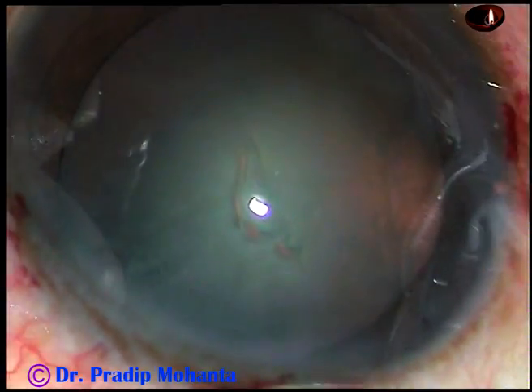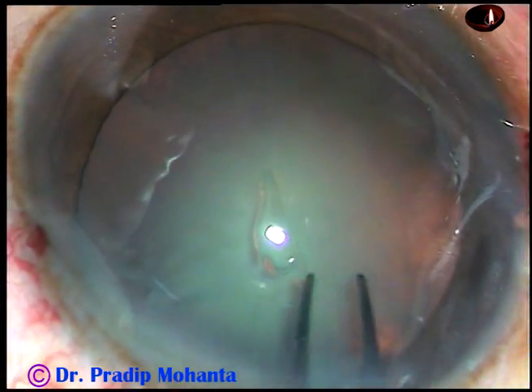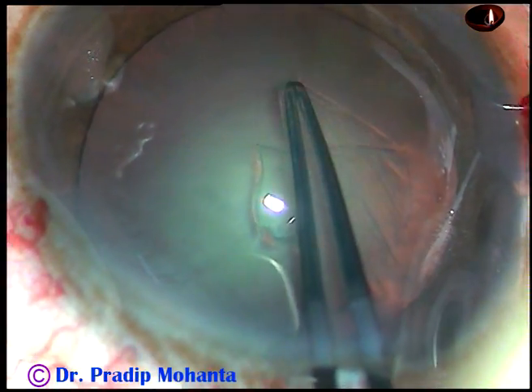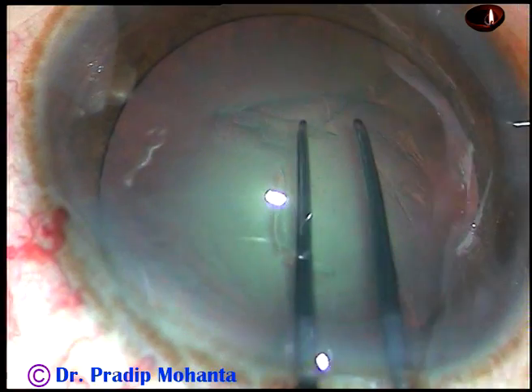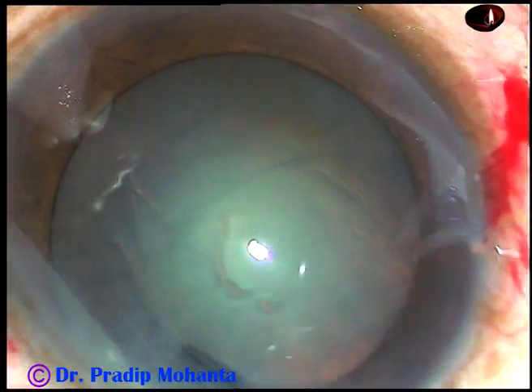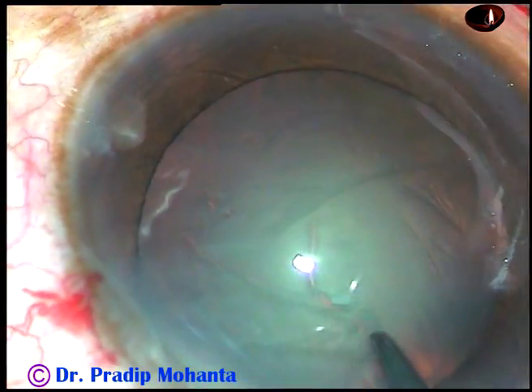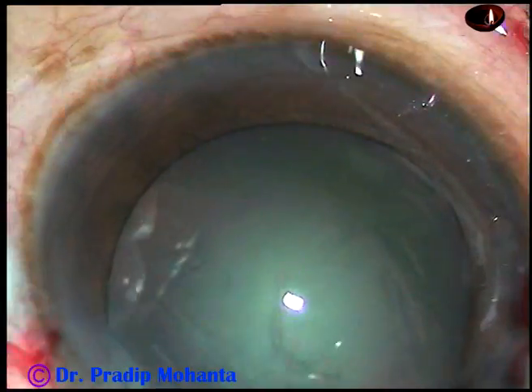Now I take a Utrata forceps, tent the anterior leaf of the main incision, go all around and perform a fairly round continuous curvilinear capsulorhexis. The rhexis is done.